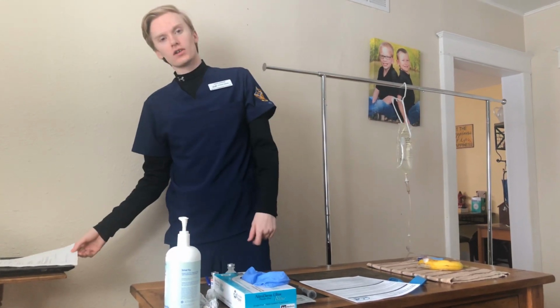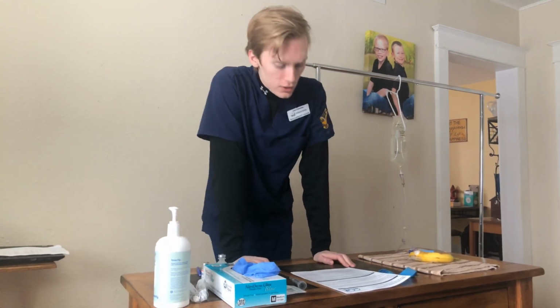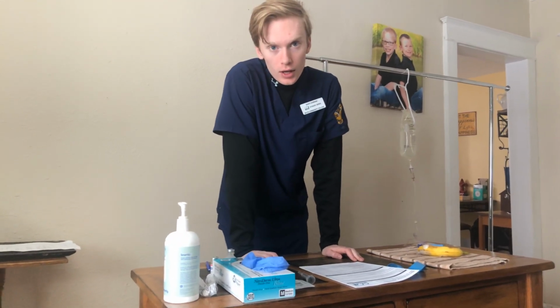Hello, my name is Dante Downing. I'm a nursing student at MCC. I'm going to be showing you how to discontinue an IV and give a push medication.